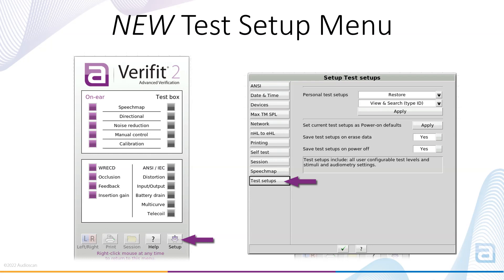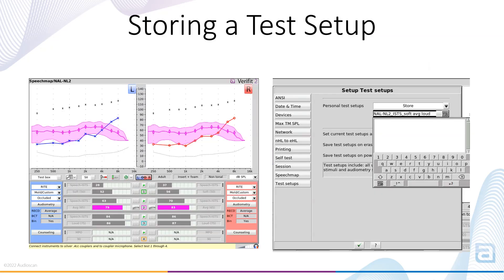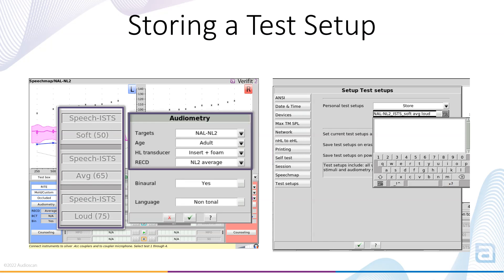From here, you are able to store a test setup, restore a test setup, or remove test setups you no longer need. To store a test setup, configure SpeechMap with the stimuli and input levels you would like to save. Next, select Audiometry and choose the targets, age, HL transducer, and RECD settings you would like to save.